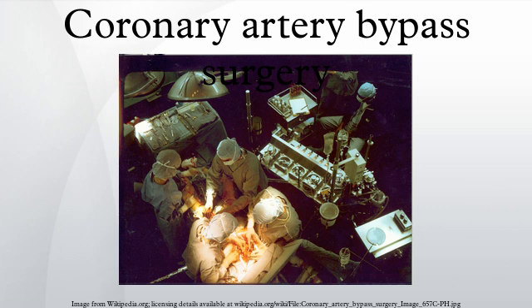The heart-lung blood circulation system and the surgery itself release a variety of debris, including bits of blood cells, tubing, and plaques. For example, when surgeons clamp and connect the aorta to tubing, resulting emboli block blood flow and cause mini-strokes. Other heart surgery factors related to mental damage may be events of hypoxia, high or low body temperature, abnormal blood pressure, irregular heart rhythms, and fever after surgery.